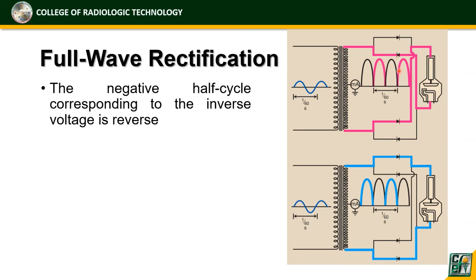So lahat yun ay dire-diretso. Kung yung half wave rectification ay nagiging flat, ito ay nagiging isang buong crest.